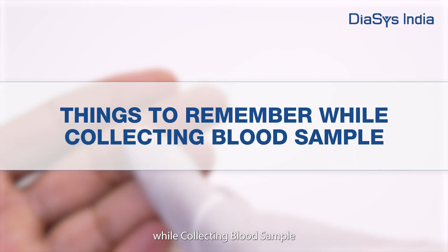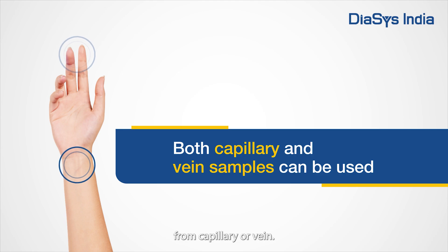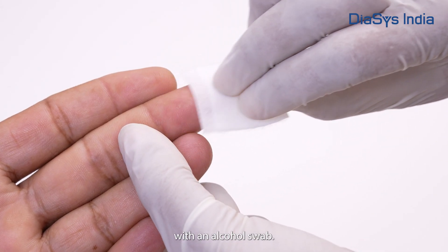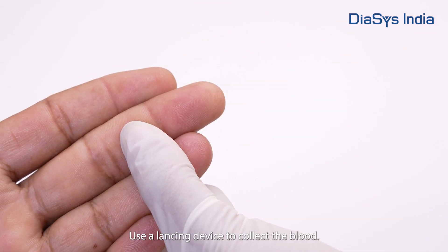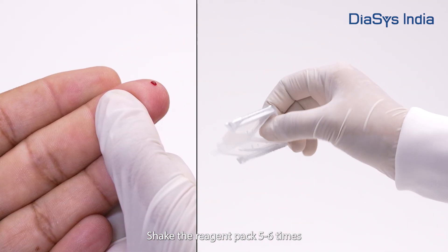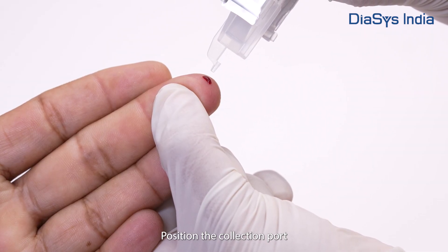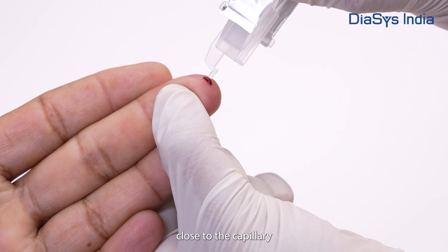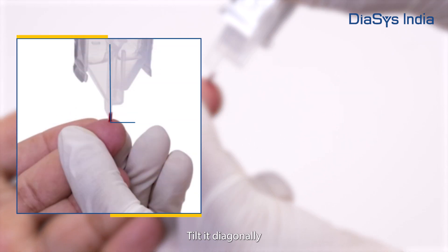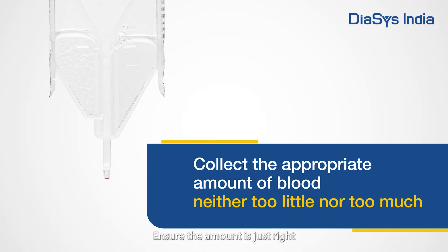Things to remember while collecting a blood sample. You need a 3.5 microlitre blood sample from capillary or vein. Disinfect the fingertip with an alcohol swab. Use a lancing device to collect the blood. Shake the reagent pack 5 to 6 times before collecting the sample. Position the collection port close to the capillary for automatic collection. Tilt it diagonally for smooth blood flow. Ensure the amount is just right — neither too little nor too much.